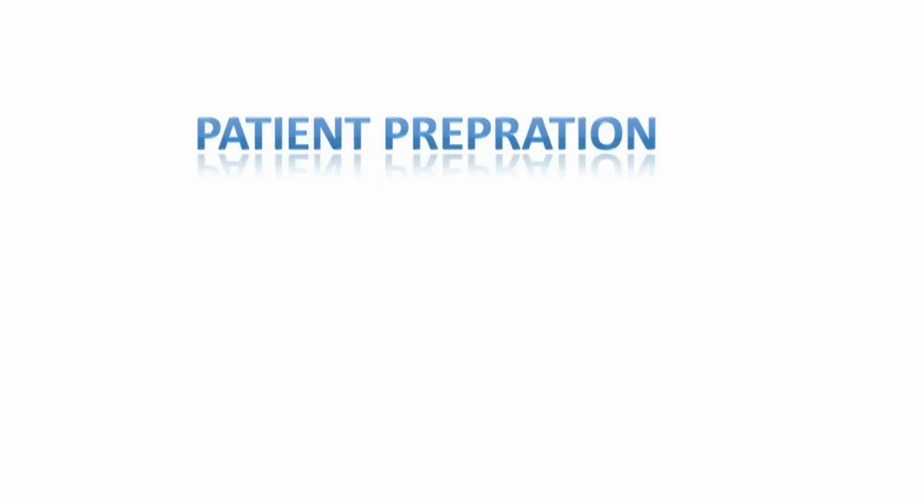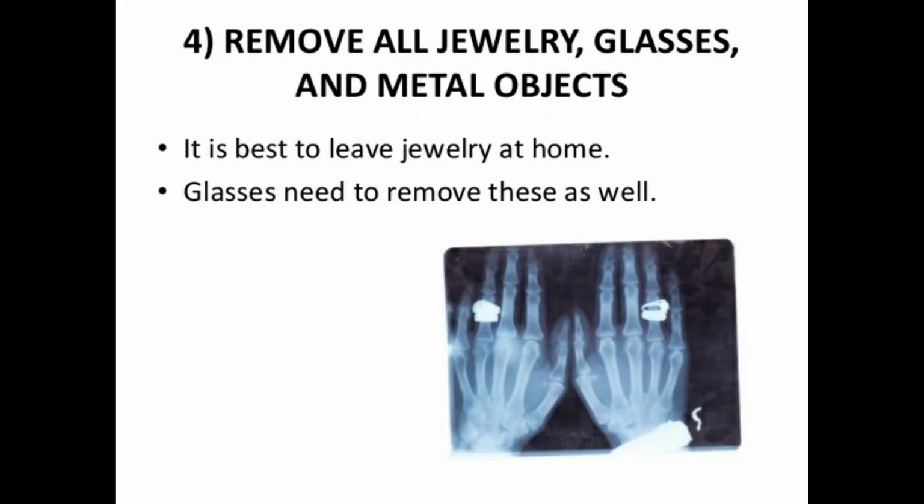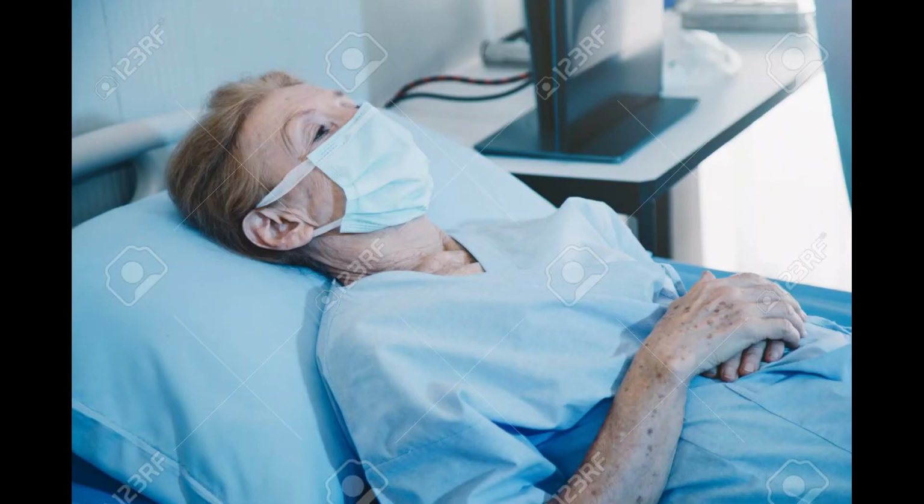Patient preparation. It means what things the patient should do before taking the chest x-rays. The patient should be asked to remove all clothing and jewelry. If required, she is asked to wear a hospital gown before taking the chest x-ray.